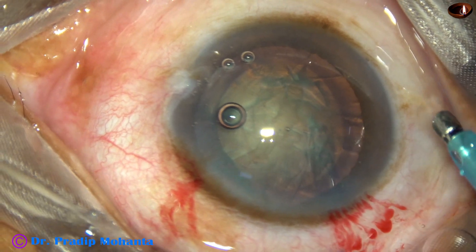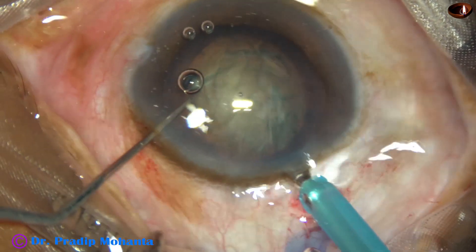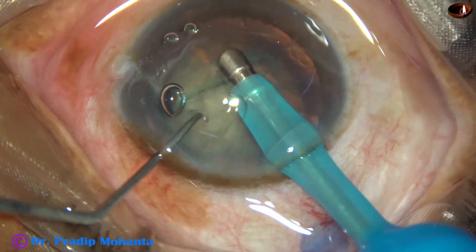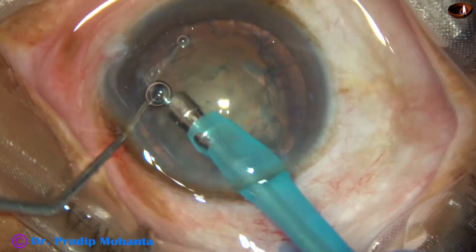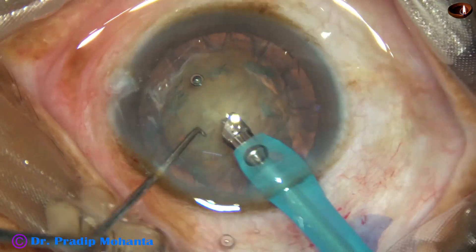At this time, the vacuum is between 50 and 100, flow rate is between 20 and 30. Ultrasonic energy is according to the hardness of the nucleus.